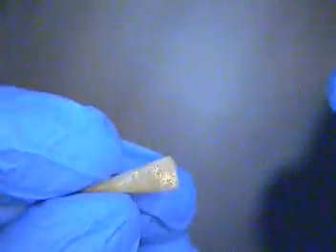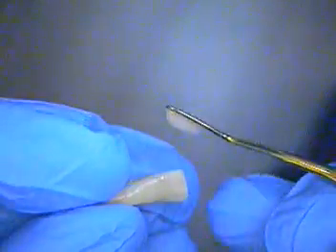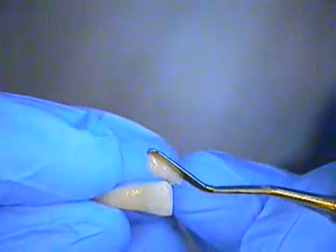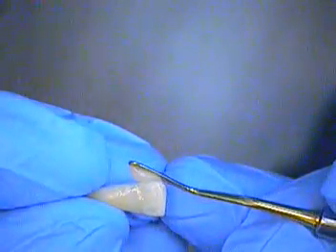Now I have the tooth that we removed. We rounded the apical region, went ahead and prepared the tooth, cleaned it thoroughly, and we added our bonding agent. Now I'm going to add the composite.